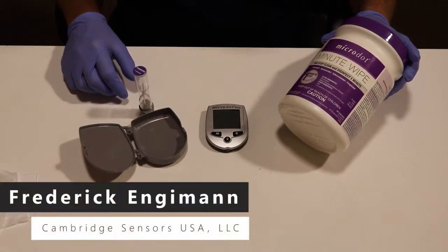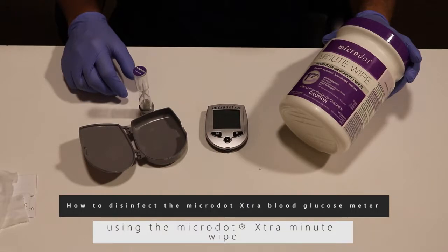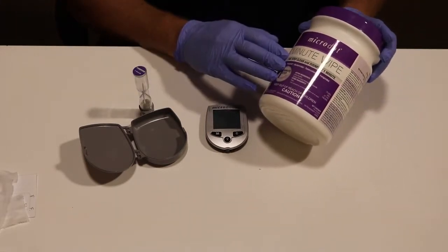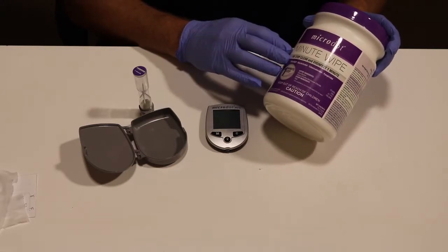Hi, my name is Fred Ingeman from Cambridge Sensors, and today I'm going to demonstrate how to disinfect the Microdot Extra Blood Glucose Meter. The first thing you'll need is your EPA registered disinfectant wipe. The Microdot Minute Wipe is an EPA registered tuberculocidal wipe with a one-minute kill.